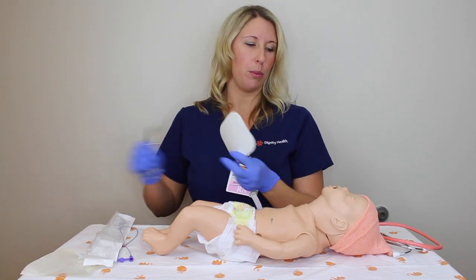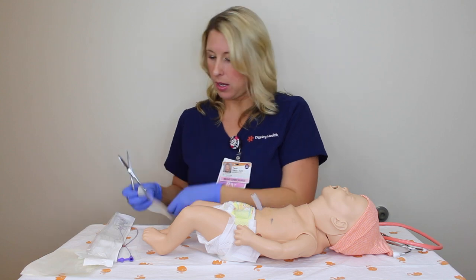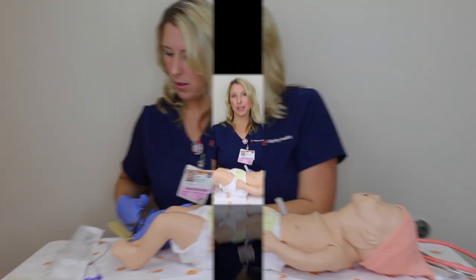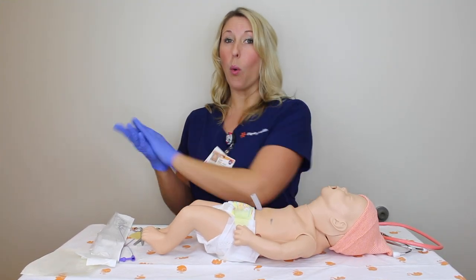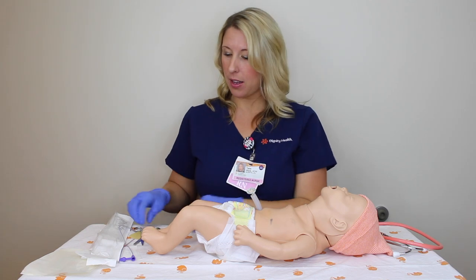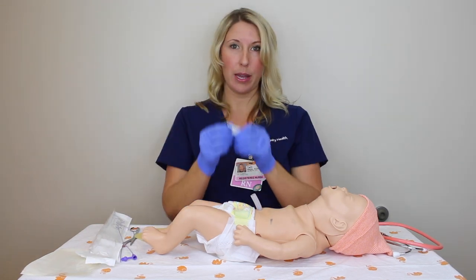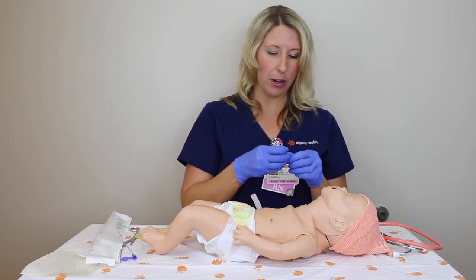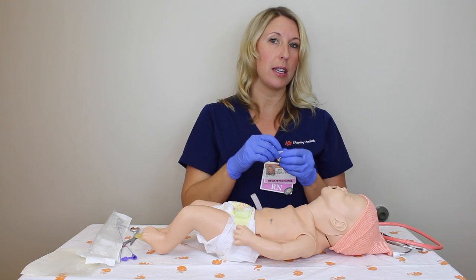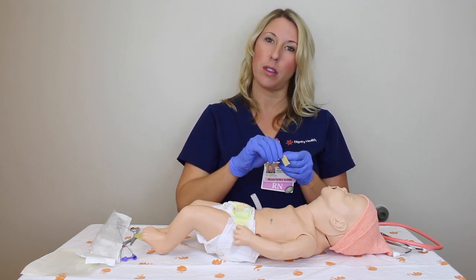You will cut the Duoderm based on which nostril you're going to use. To begin, wash your hands, place on a set of gloves, and cut a piece of the barrier protector for your baby. Place the barrier protector underneath the nostril and across the cheek so that we do not disturb the skin when we secure the NG tube.